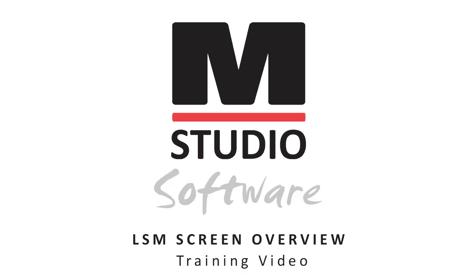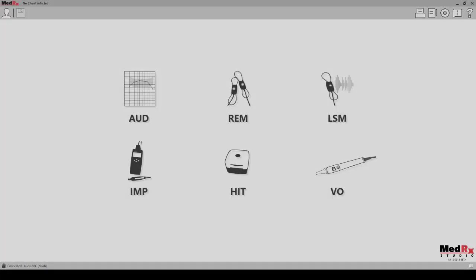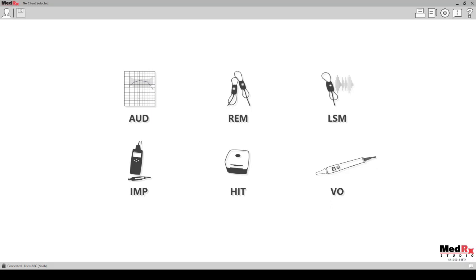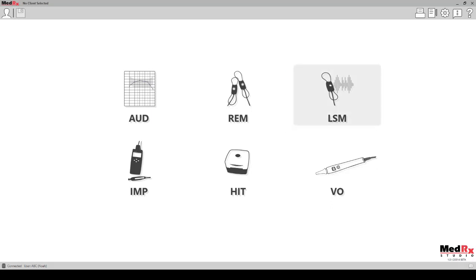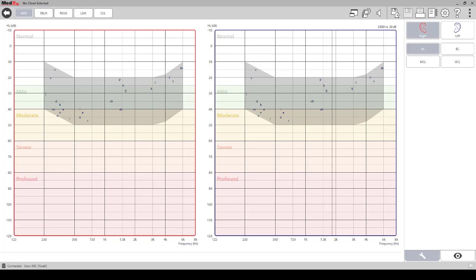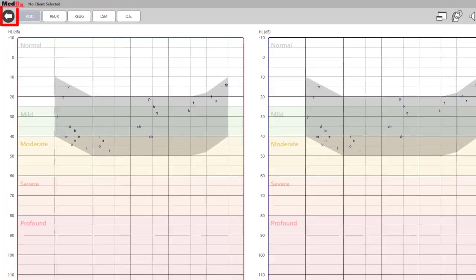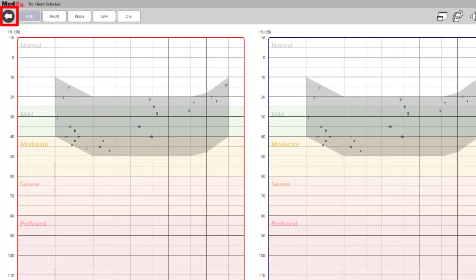LSM screen overview. Select the LSM module from the main screen. The arrow icon in the top left corner of any screen will take you back to the main screen.